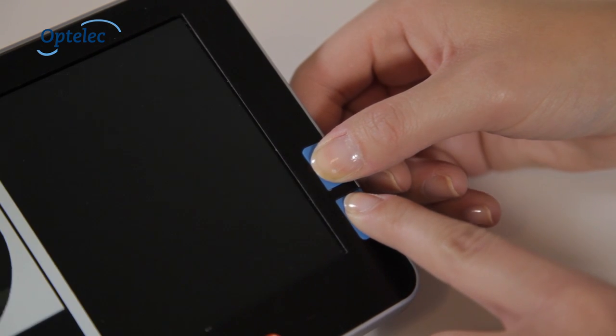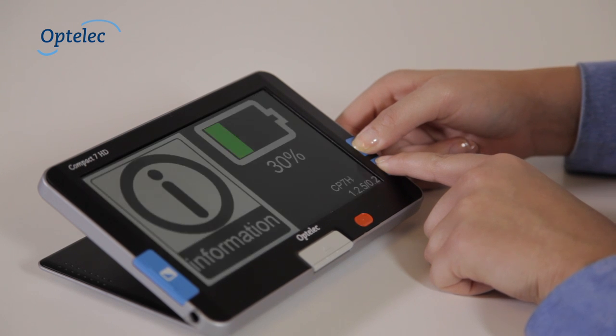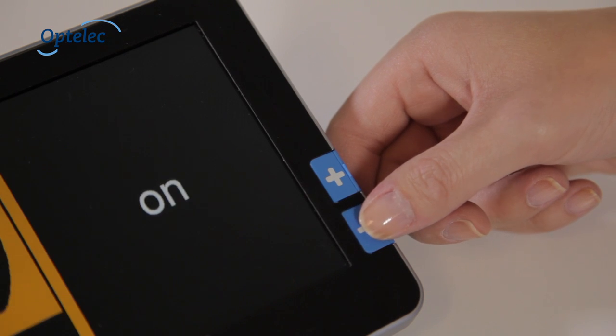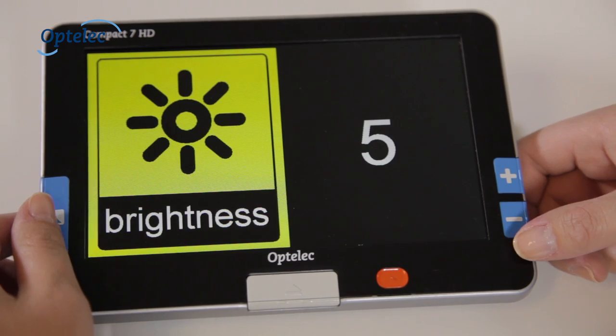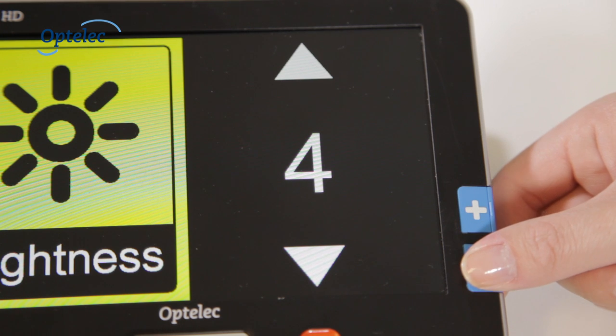Simultaneously press the Plus and Minus buttons for at least one second to activate the menu. This also allows you to view the battery level. Press the Plus and Minus buttons to browse through the menu. The Mode button allows you to confirm your selection.